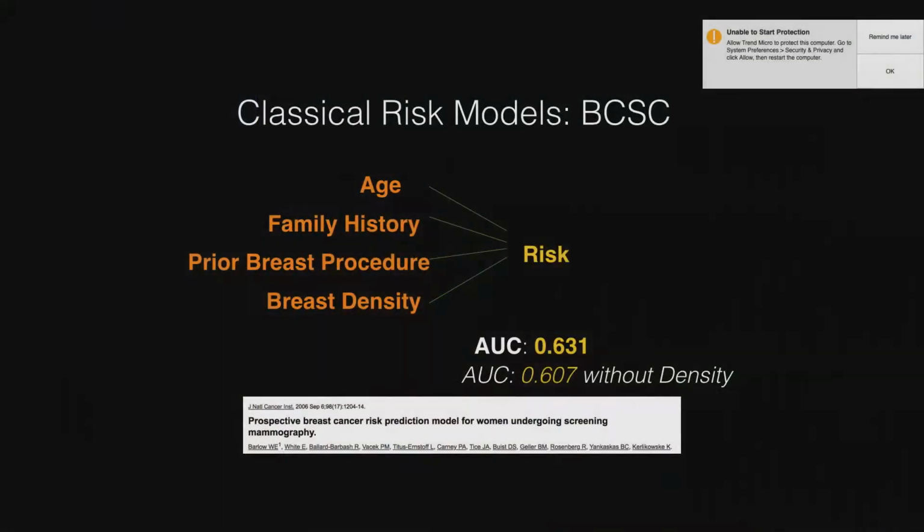Now, modeling breast cancer risk, as Connie already said, is not a new problem. It's been quite researched in the community. The more classical approach is we look at other global health factors: the person's age, their family history, whether or not they've had menopause, and other factors we can say are markers of their health, to try to predict whether this person is at risk of developing breast cancer. People have thought that the image contained something before. The way they've thought about this is through a subjective breast density marker. And the improvements seen across this are marginal, from 61 to 63.